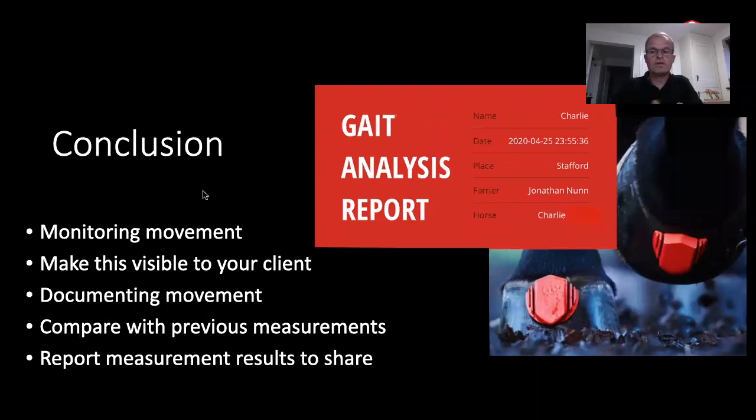During the process, we may be five shoeings in, and we'll look back to when this horse was at his best. It's been suggested that this is a great device for measuring a horse's optimum performance time after shoeing. We don't always see what we want to see straight after shoeing. In very extreme cases, like Charlie's, it was evident that there was going to be a big improvement just by taking the nail heads down. But sometimes changes can be a little difficult to get used to.